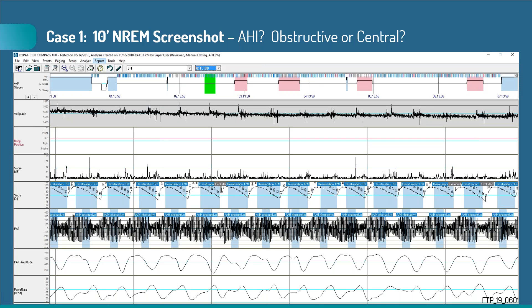Airway obstruction is highlighted by the finding that this patient is snoring quite a bit. The obstruction may be worse in some of the REM sleep cycles compared to non-REM. To confirm these patterns, we can go into the recording itself. What we're showing here is a 10-minute screenshot in non-REM sleep. The whole hypnogram for the entire night appears on the top panel. Below we see actigraphy, body position, oximetry, PAT signal, the amplitude of the PAT signal, and pulse rate. In this 10-minute stretch, we see the reciprocal pattern in evidence 15 or 16 times — characterized by a marked attenuation of PAT amplitude and a concomitant rise in pulse rate. These are the microarousals that terminate the apnea.